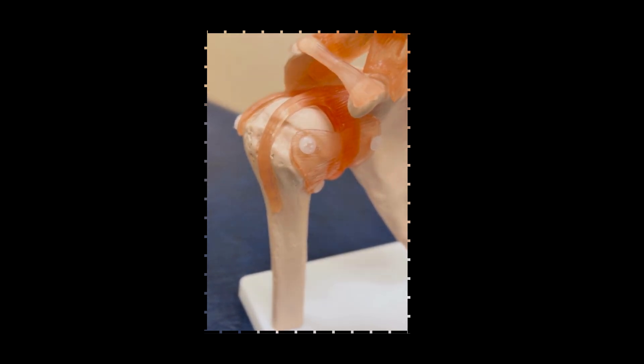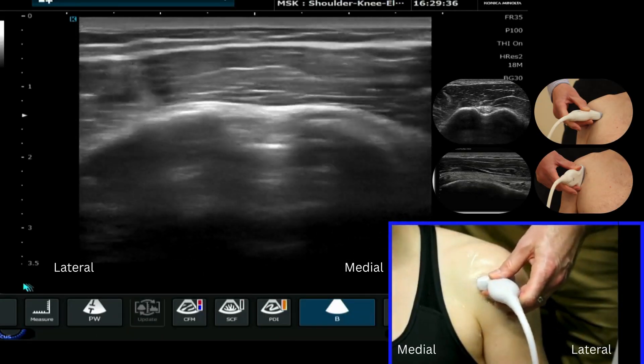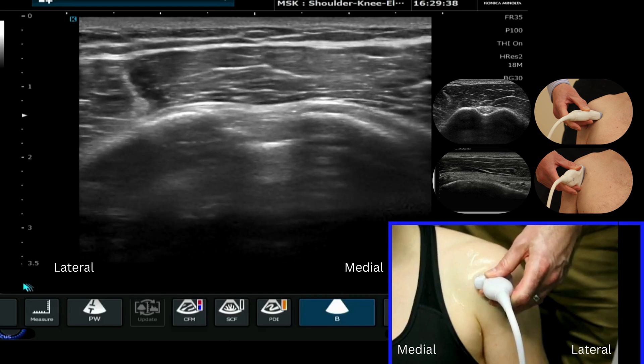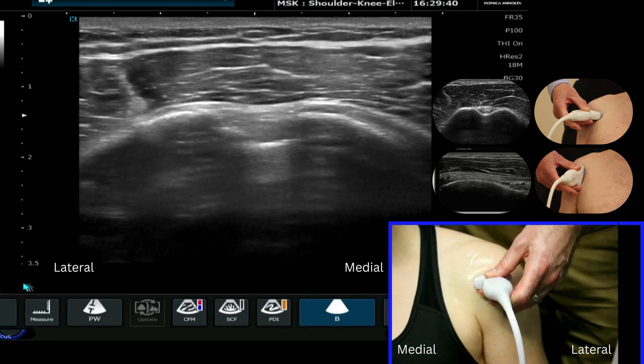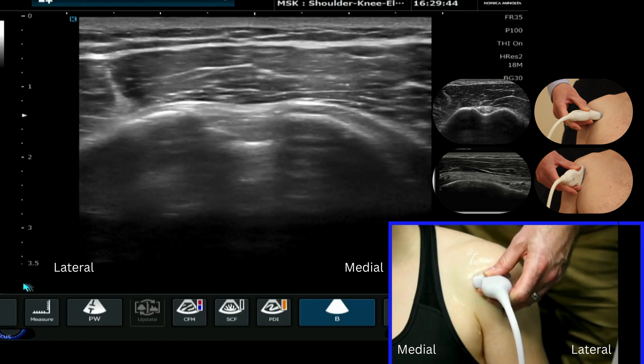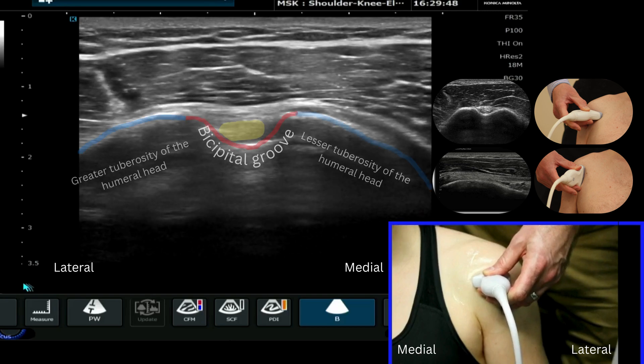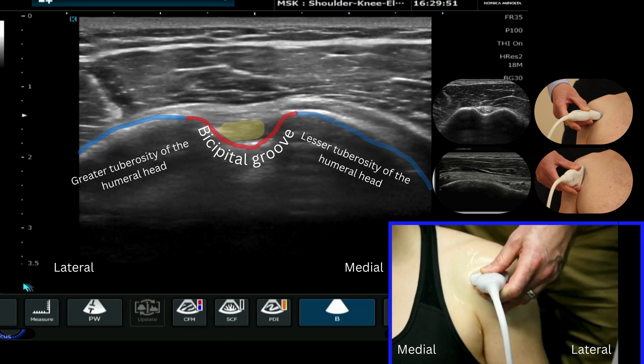I hope you enjoy the tutorial. For this video tutorial we're going to look at the long head of biceps in the bicipital groove, and we're going to start with our patient sat down, arm in a neutral position, probably very slightly externally rotated, and we can see the long head of biceps here sat in the bicipital groove.